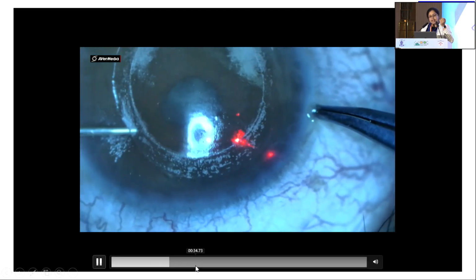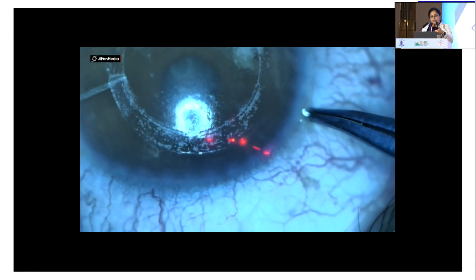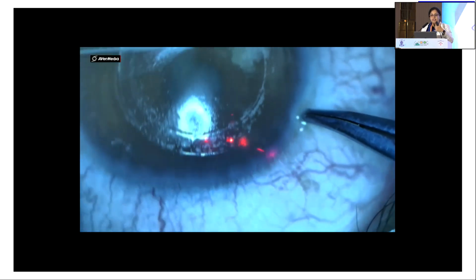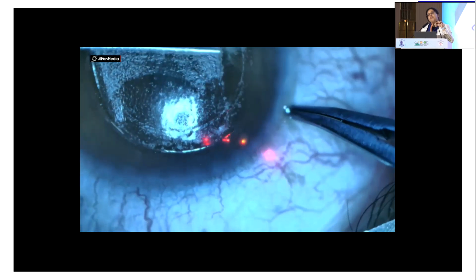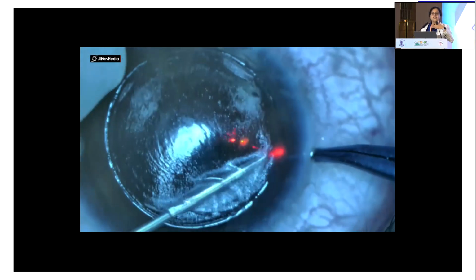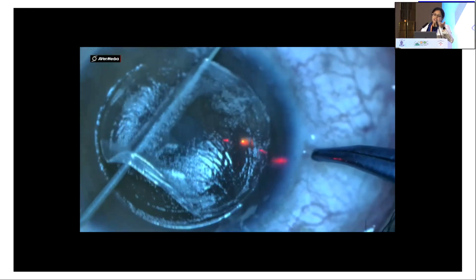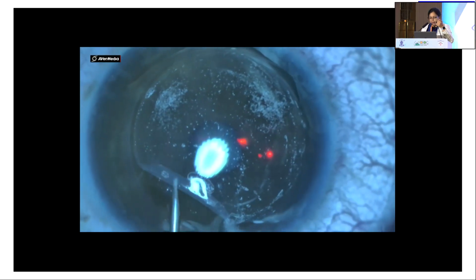So it's just like lifting a LASIK flap, you just delineate. And as you can see, when we cross over from this lamella towards the center, it's a seamless transition. There is no difficulty in finding the original cap interface, and there is no forceful dissection or release of adhesions. This is the advantage of doing a circle pattern, that you can convert the original cap into a flap without having any risk of multiple interfaces at all. After this, once you lift the flap, it's all standard excimer laser ablation, after which you refloat and reposition the flap.